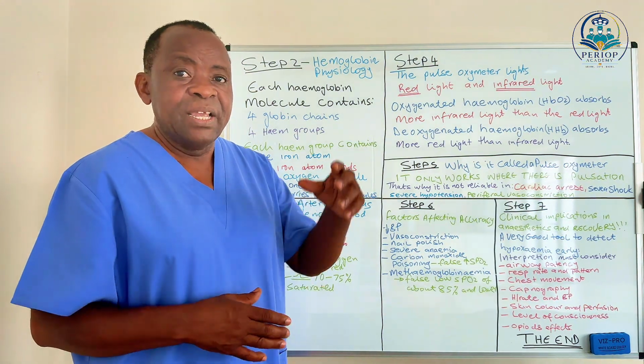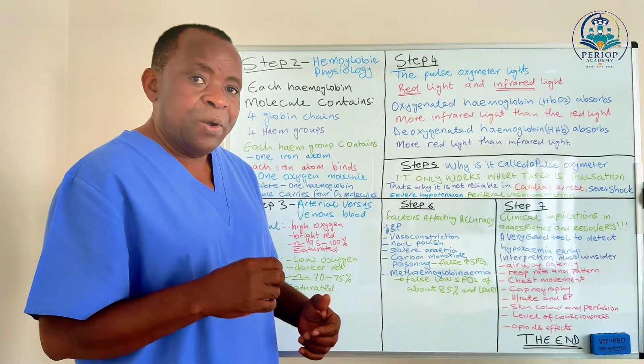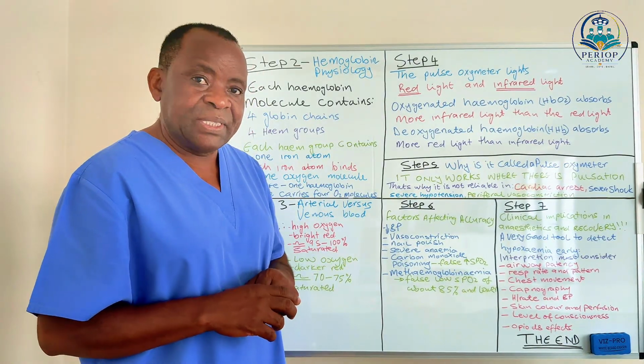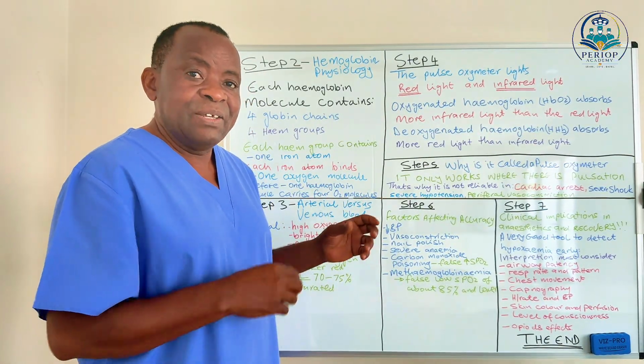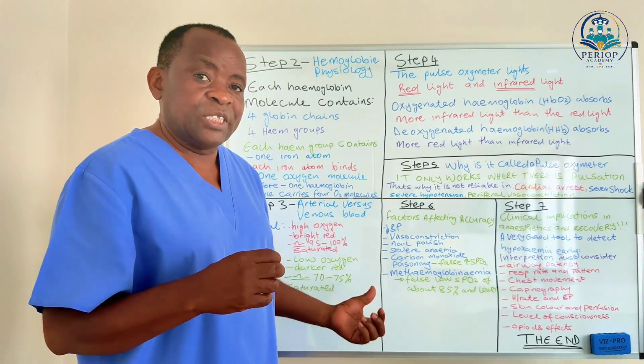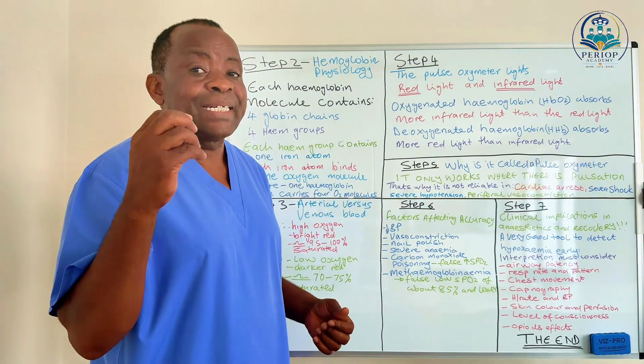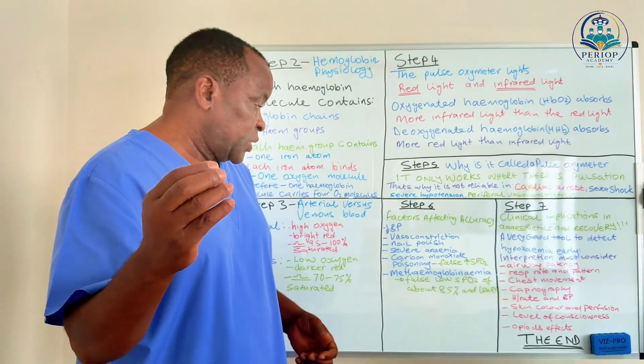In this case, we undertreat the patient with these results. So with patients with carbon monoxide poisoning, bear in mind whatever values you are seeing on there, they may not be accurate because of the behavior of the carbon monoxide's relationship with oxygen.